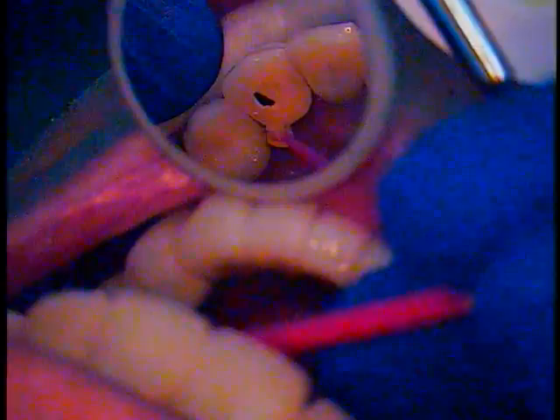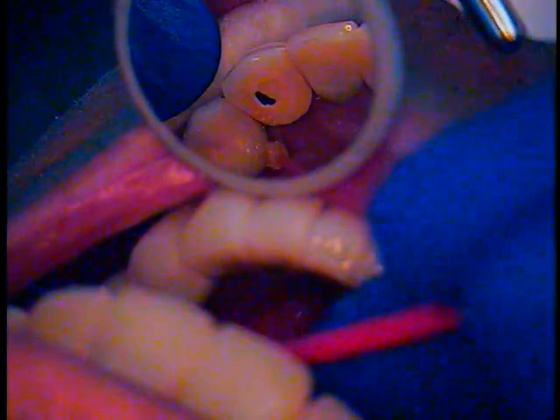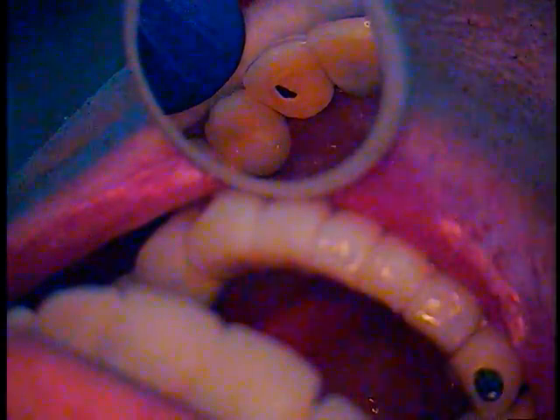Now the key is to use a lot of water when you're prepping through ceramic and metal. You really don't want to heat up the ceramic component. This is, I believe, from Pulp Dent — the ceramic etch.